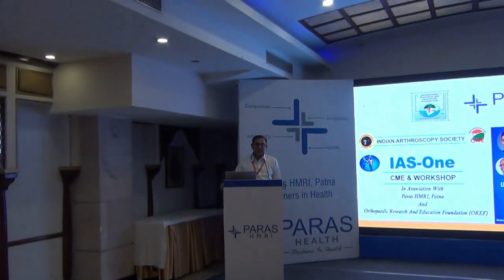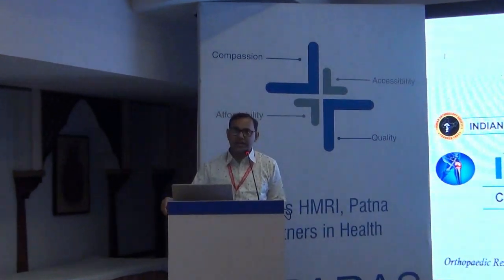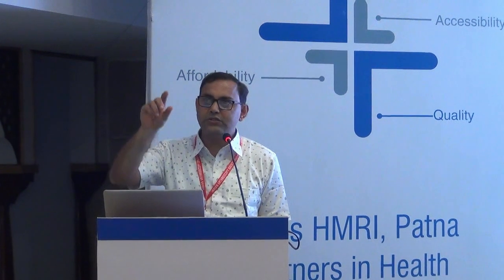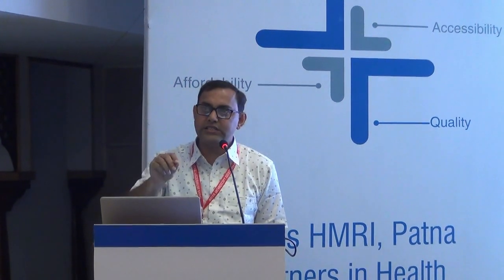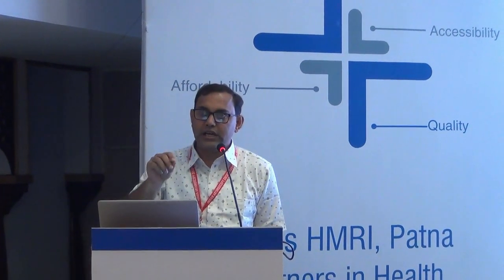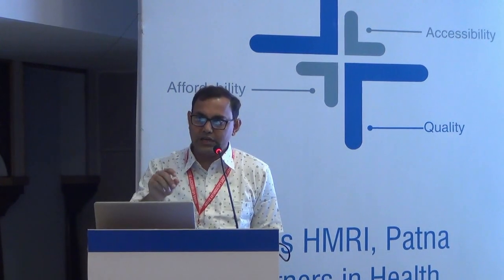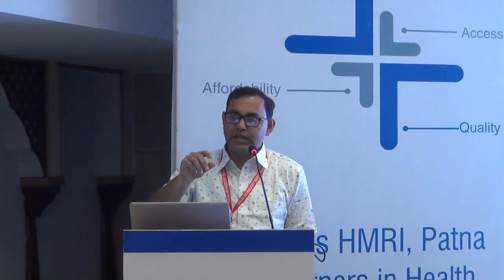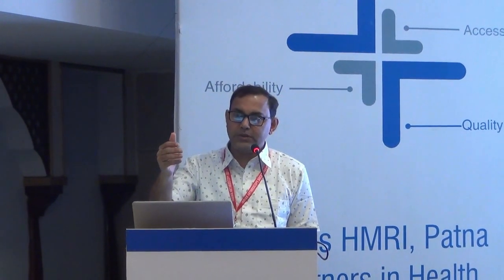See, in most cases the fresh cases are easy to find, because first you have to see where the meniscus is sitting without any tension. So tensionless repair is important, and the meniscus root is in between the tibial PCL attachment and the ACL attachment.